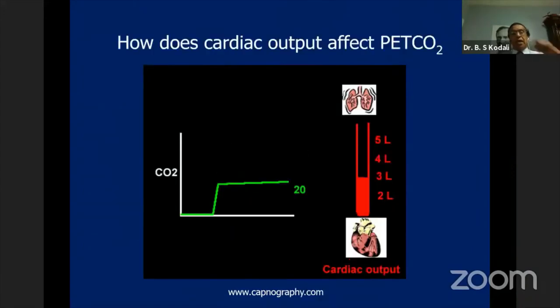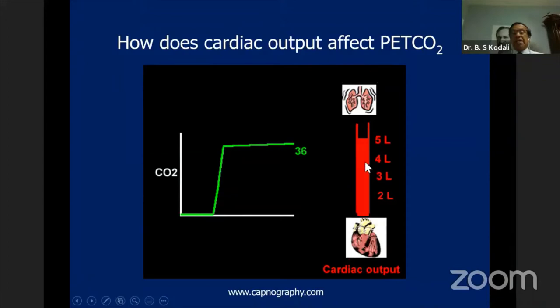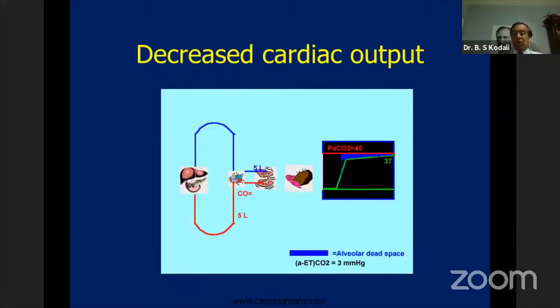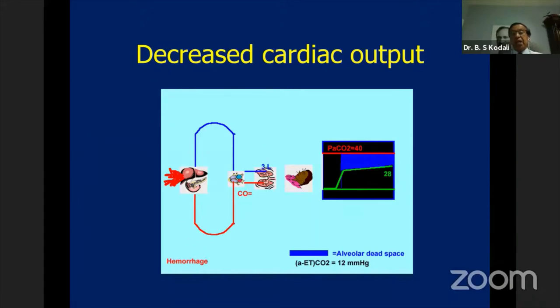This is a sedation capnogram — the capnograms before sedation versus what happens later: the respiratory rate has decreased, and the height of the capnogram has decreased due to over-sedation. The end-tidal CO2 linearly reflects cardiac output. During abdominal or liver resection surgery, if there is a sudden substantial blood loss, cardiac output decreases and end-tidal CO2 decreases. Whenever end-tidal CO2 decreases dramatically for a given ventilation, you must look at the other side of the drapes to check for substantial blood loss.